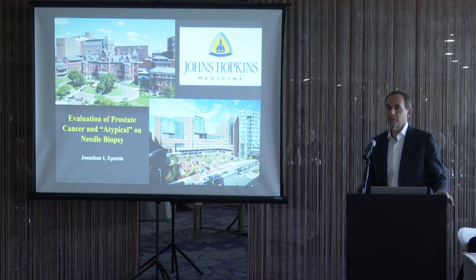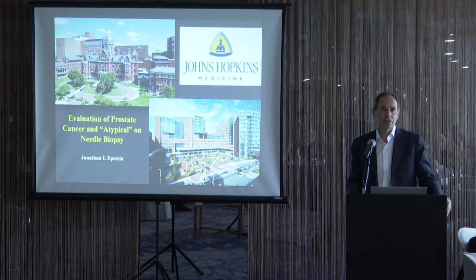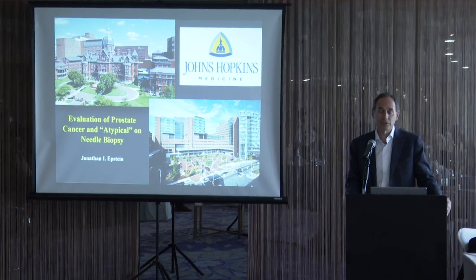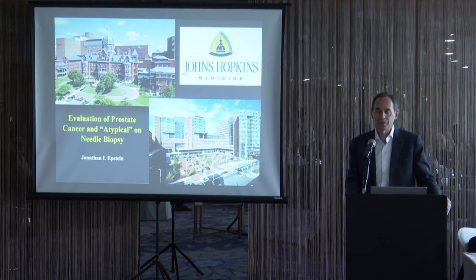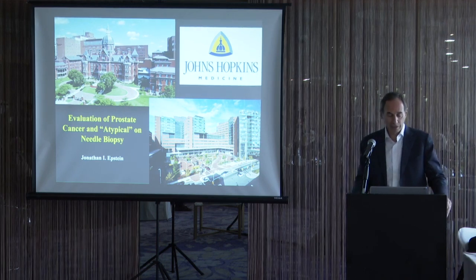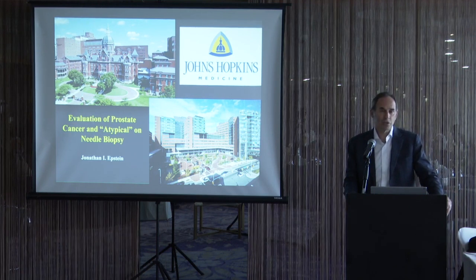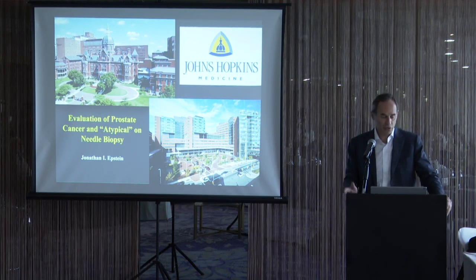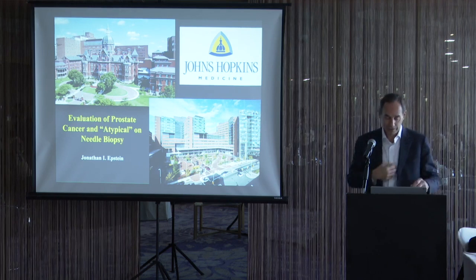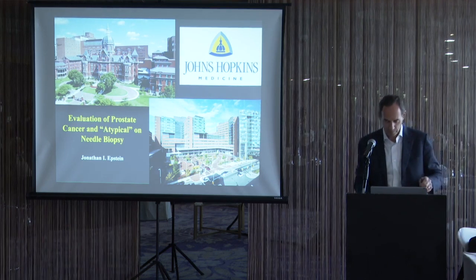So today, between today and tomorrow, we'll be covering a wide range of urological pathology specimens throughout most of the organs, between the lectures and the slide seminars. I'll start with probably the most common specimen that you see in urological pathology, which is the evaluation of prostate needle biopsies. Prostate cancer worldwide is one of the most common diseases.